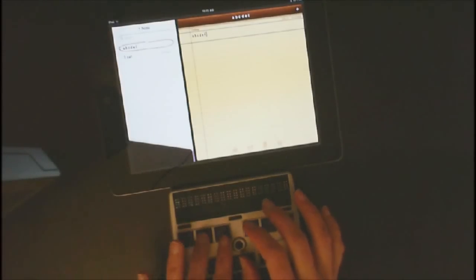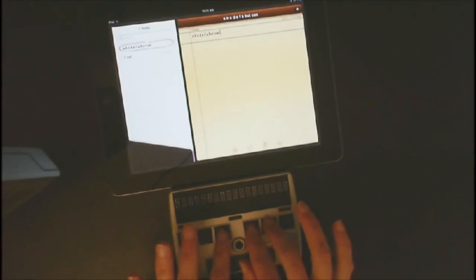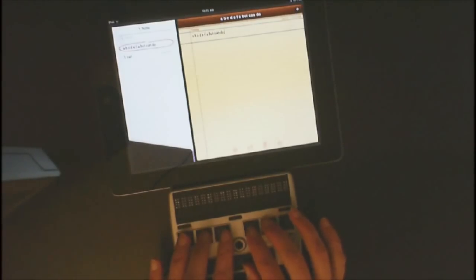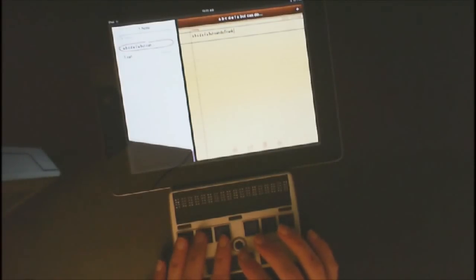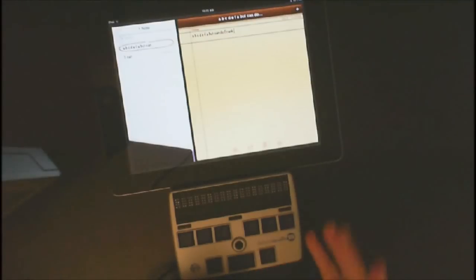Now we're going to do the alphabet again. A — space. B turns immediately to 'but.' Space. C turns to 'can.' D turns to 'do,' and so forth. So let's go ahead and practice brailling some names. I'm going to braille the name Frank. If I braille slower, it would say each of the letters slower. But you want the child to gain fluency in their brailling, and of course there are autocorrect tricks also.